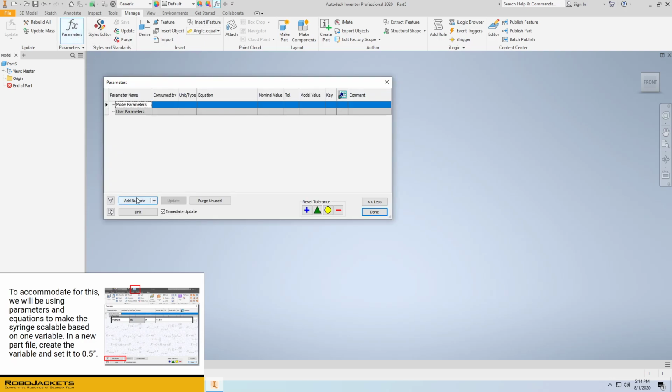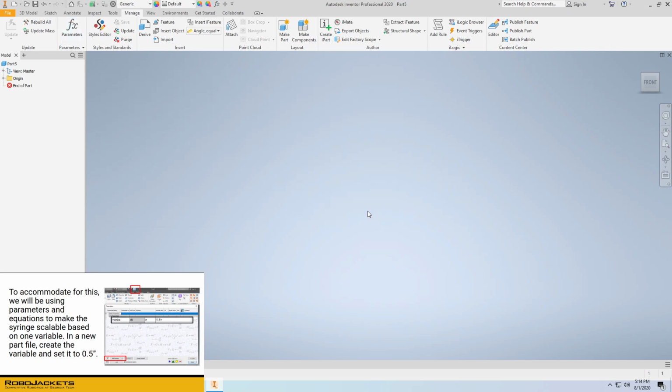Here, you'll be able to add a parameter. We'll name it main dia, and then edit the equation that determines its value to be 0.5 inches. And this is a good starting location.